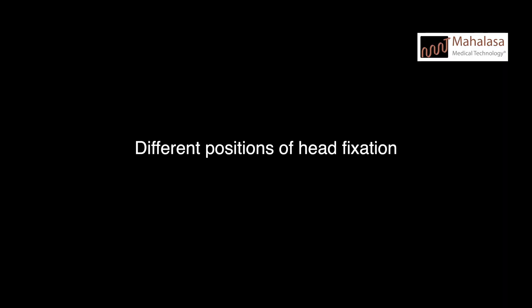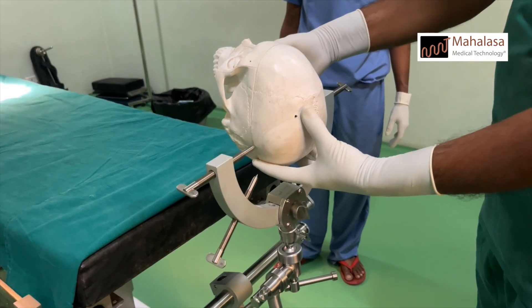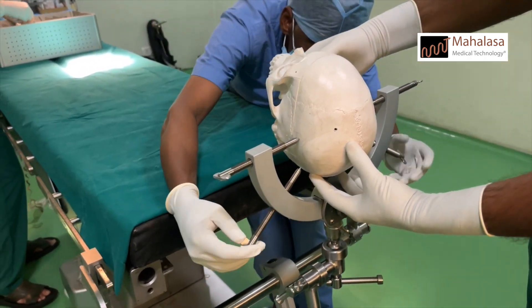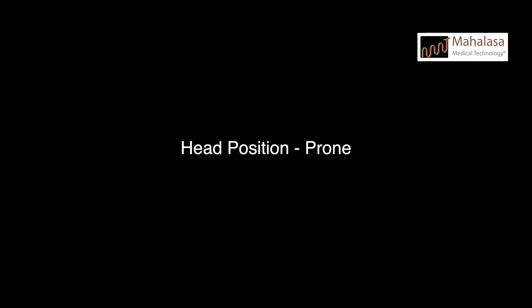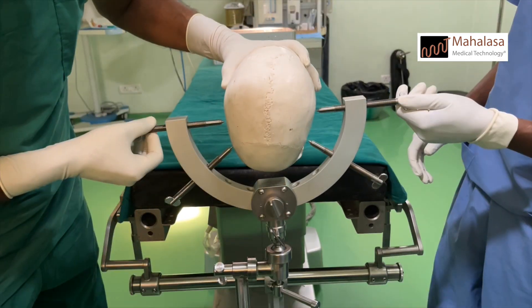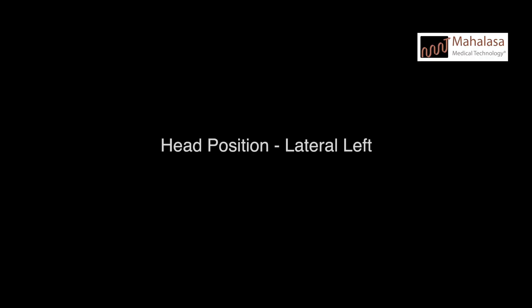The head can be positioned in different ways depending on the area of interest. Let's look at the fixation in supine position first. Prone position.